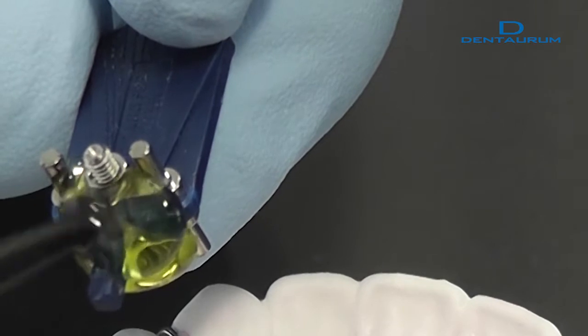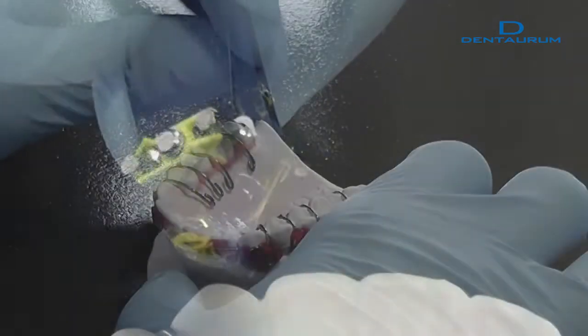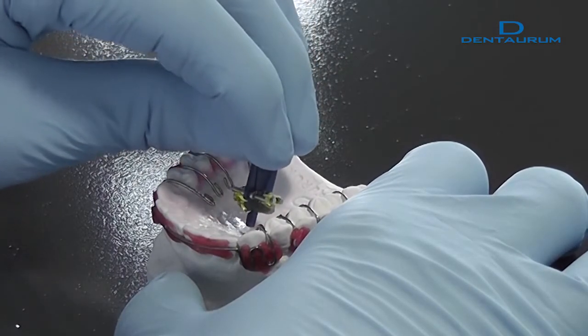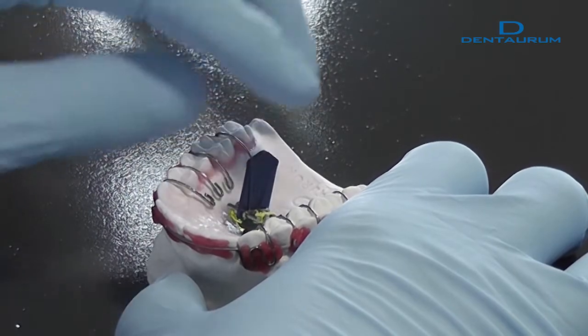First, the expansion screw is completed. It is completely surrounded with OrthoKryl LC. It is important that the expansion screw is completely embedded in the acrylic and that no air bubbles form.